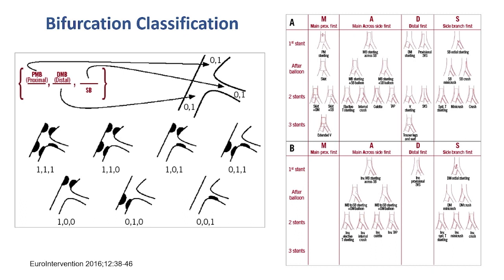And the second one is, what is the length of the disease portion of this side branch? So those two things you do need to know: the angulation and the length of that side branch disease. Okay? Why is that? Because the longer this disease is, the more chances you have that that side branch will need to be treated independently of the main branch.